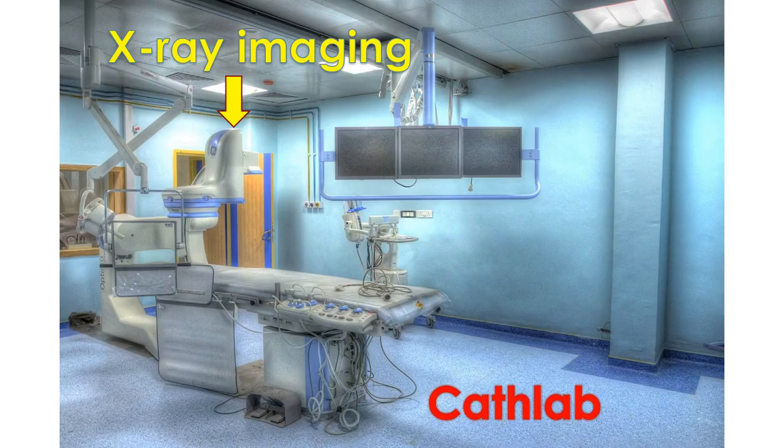Temporary pacing is usually done in the cardiac catheterization laboratory (cath lab) with X-ray fluoroscopic imaging, which allows visualization of the passage of the lead into the heart. In an emergency, it may have to be done at the bedside in the intensive care unit. Special balloon-tipped pacing leads which follow the bloodstream are useful in such cases. Location of the lead tip can be assessed from the pacing ECG pattern in such cases.